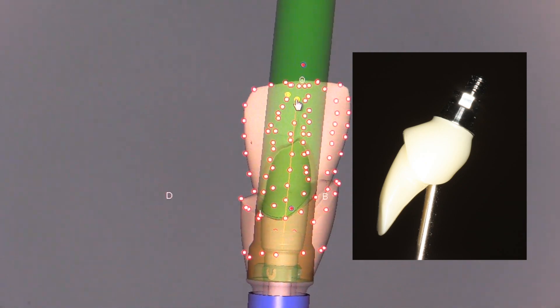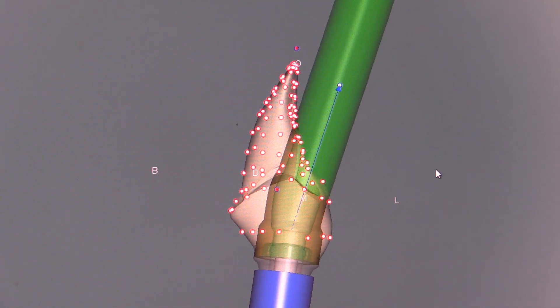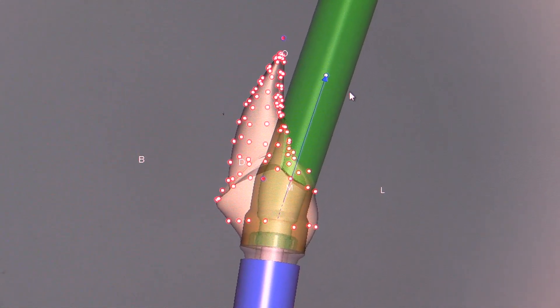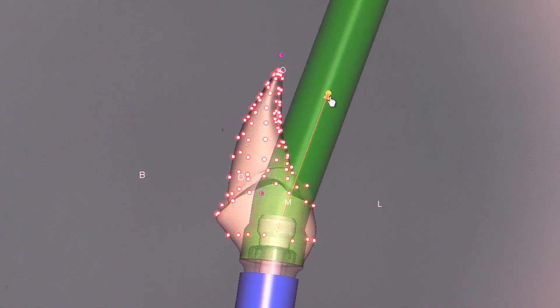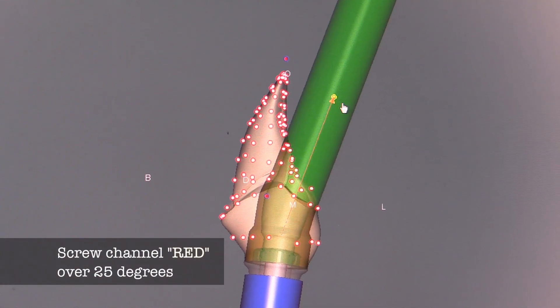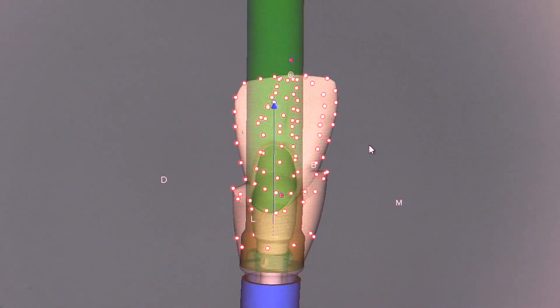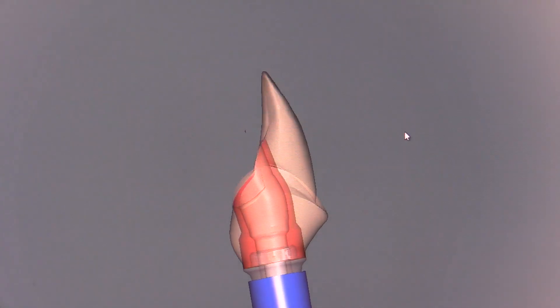We can tip the channel from mesial to distal to put it in the ideal position. Watch what happens when we tip the channel back more than 25 degrees — it turns red. This gives us a visual signal saying that the channel has gone too far and that the technology will not work in this particular situation.